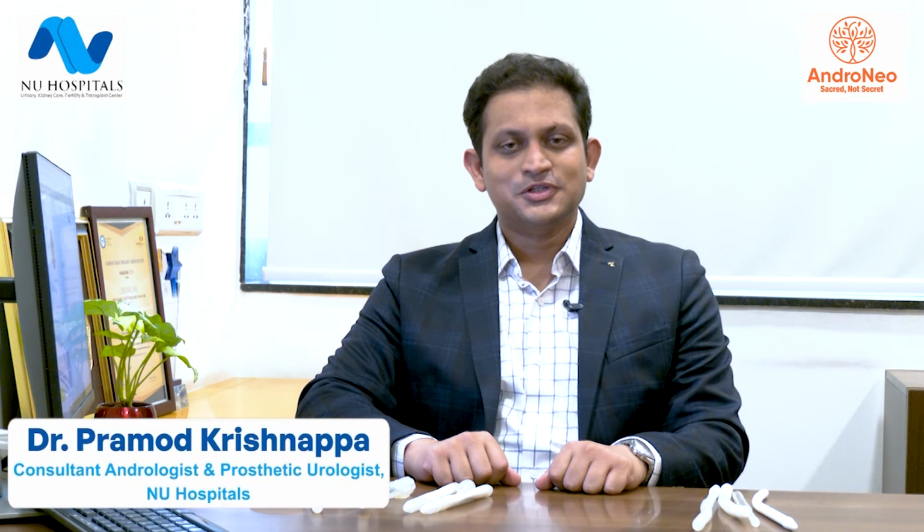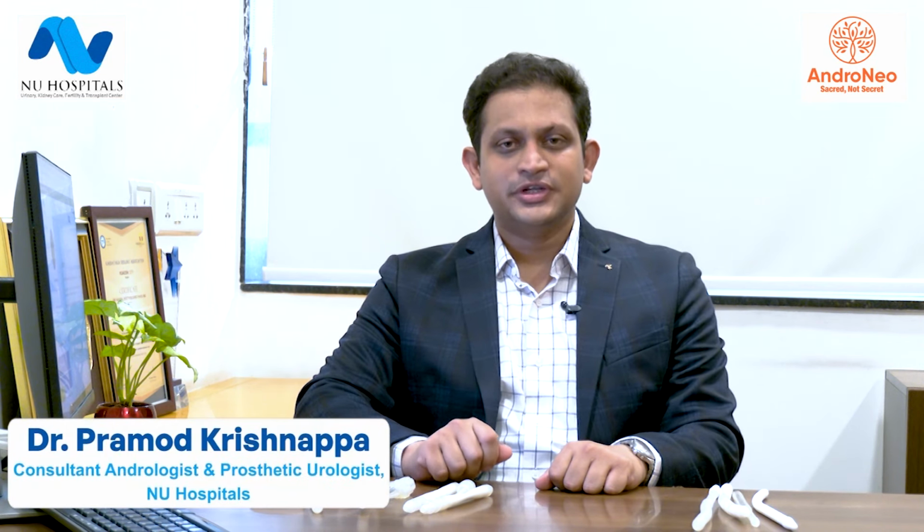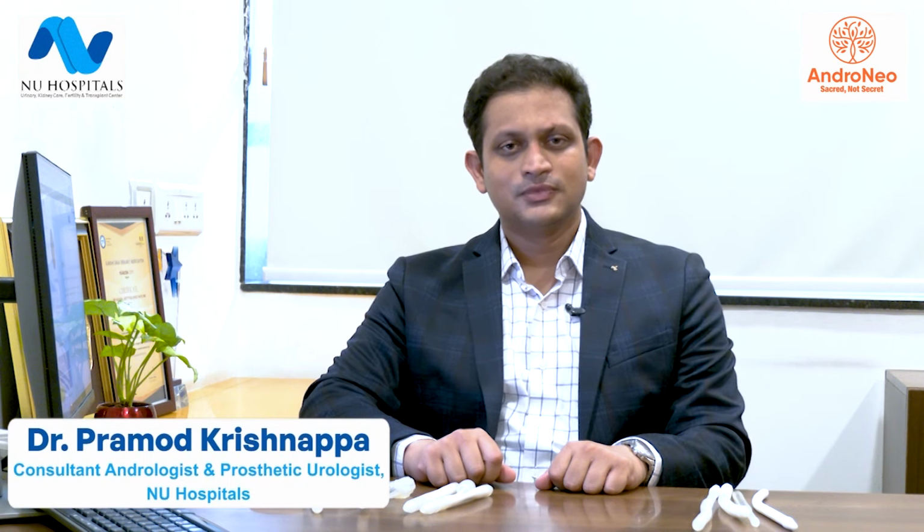Penile implant surgery is one of the modalities to treat erectile dysfunction. Most men, when the tablets and the injections don't work, usually get a penile implant surgery. The American Urological Association guidelines in 2018 clearly mentioned that a penile implant surgery need not always be the last option. In fact, it could be the best option for a particular patient.